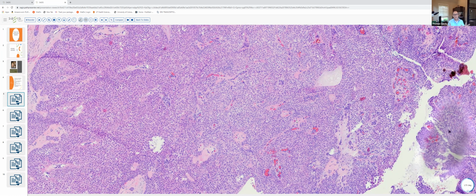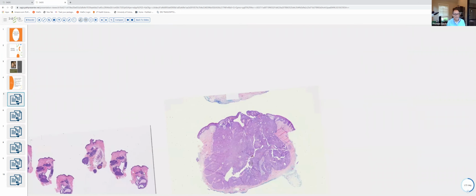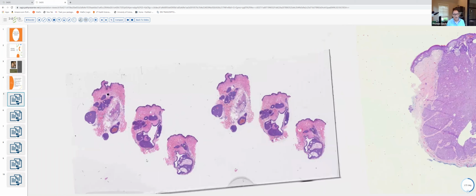And in both instances, because they are eccrine ductal tumors, the tumor islands are going to contain some eccrine ducts, which are usually cuticle lined, and some of the ducts, of course, will contain sweat. So that's kind of how the two are similar. Well, let's go ahead and look at each one of them individually and kind of discuss the differences.